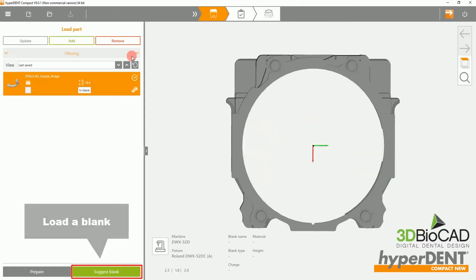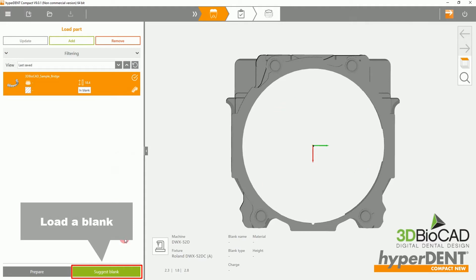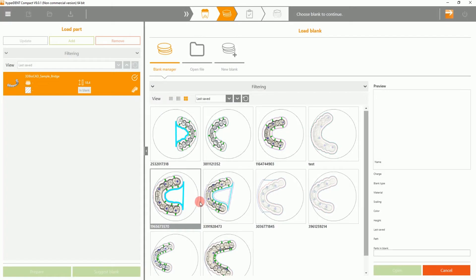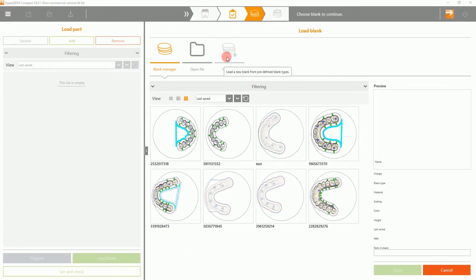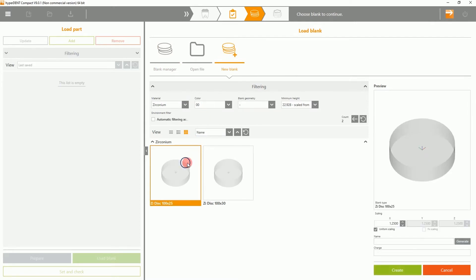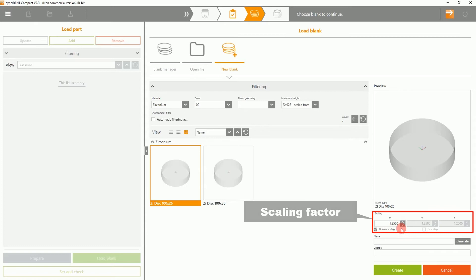Please select the Suggest Blank, then click the option New Blank. Here, you can not only select a preset blank, but you can also change the scaling factor to whichever your liking is.